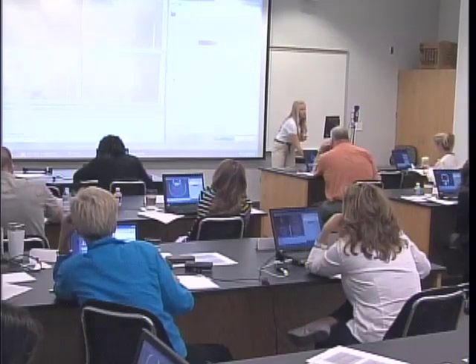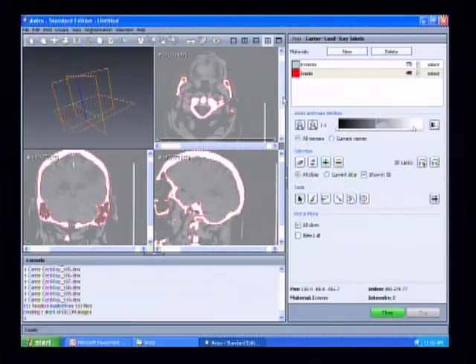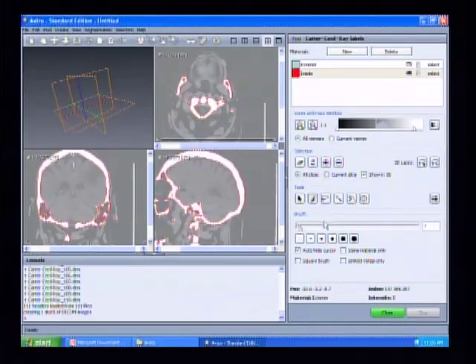If you look up here now, I have it set up to a place where you can see the main shape of that vertebral body. I know that this is separated from my skull, and I know that that's a vertebral body. So I can take my paintbrush in this view and just start going over it. I don't have to be accurate here because I want to make sure that I cover that entire area.